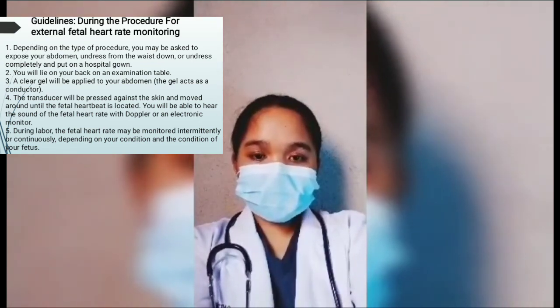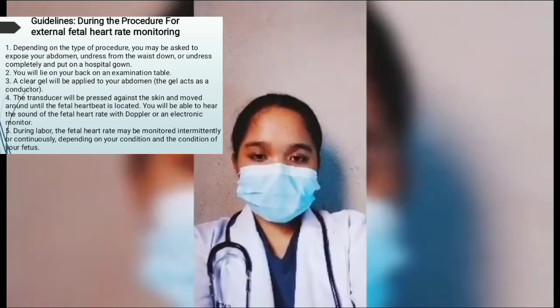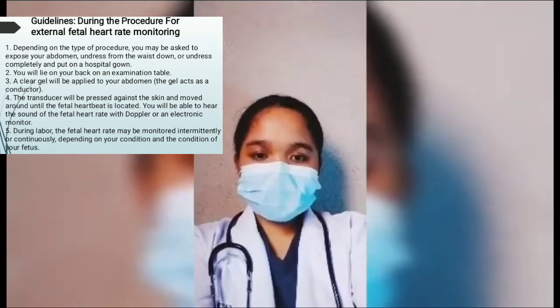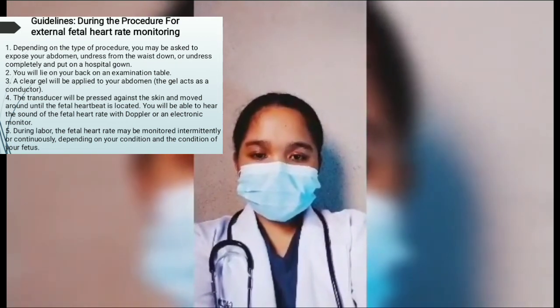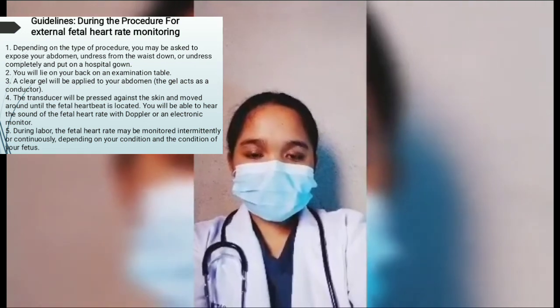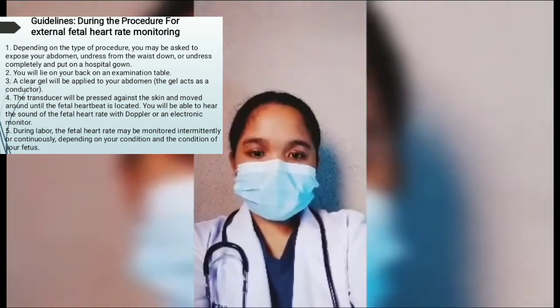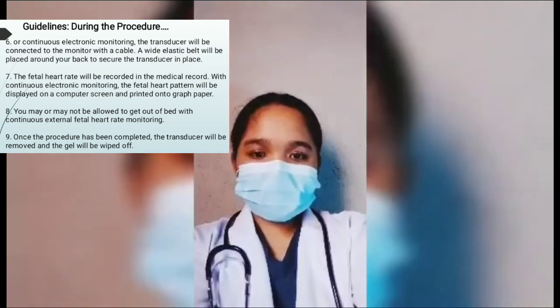Second, you will lie on your back on an examination table. Third, a clear gel will be applied to your abdomen. The gel acts as a conductor. Fourth, the transducer will be pressed against the skin and moved around until the fetal heartbeat is located. You will be able to hear the sound of the fetal heart rate with Doppler or an electronic monitor. Fifth, during labor, the fetal heart rate may be monitored intermittently or continuously depending on your condition and the condition of your fetus.